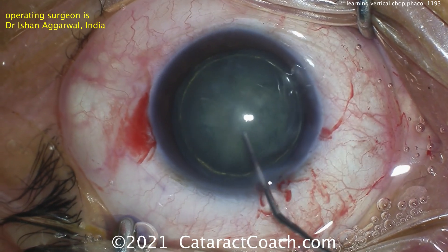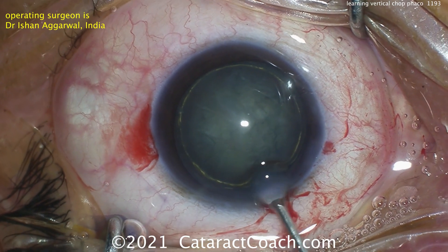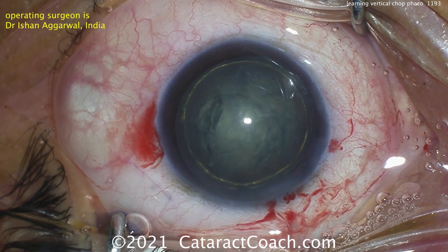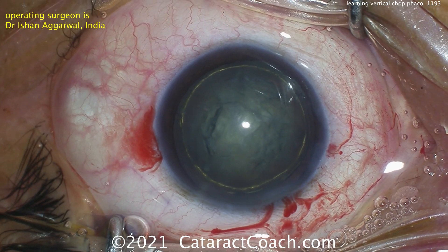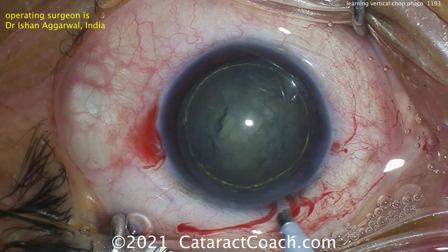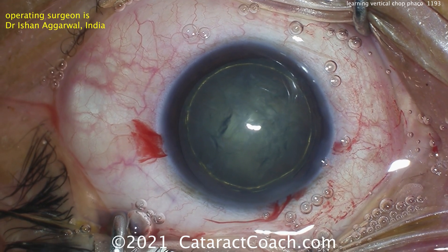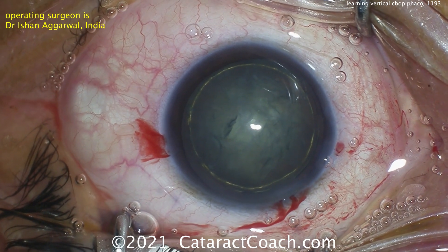The key here is placement of the instruments. You need to have a high vacuum setting — 400 or more millimeters of mercury. Higher flow is what I prefer, though the flow is not as critical. The key is to hold the nucleus with the phaco probe, and when you hear that peak of the vacuum — that's the holding power — then you chop. Both the chopper and the probe are going to be placed within the confines of the rhexis.